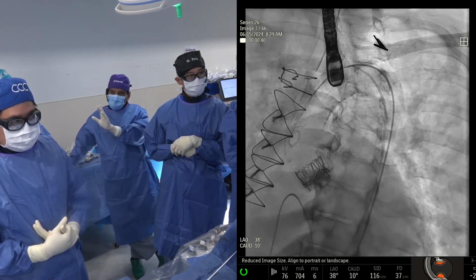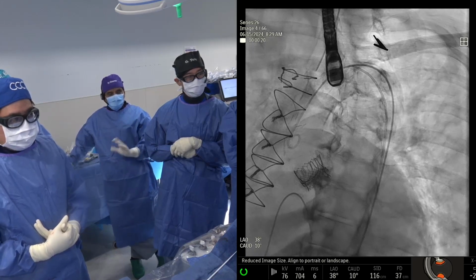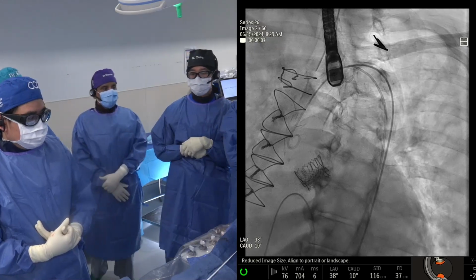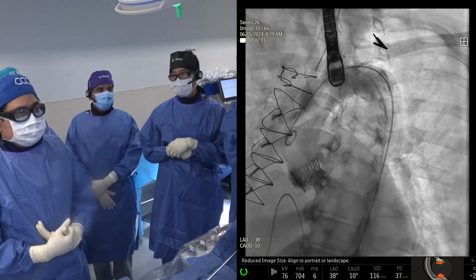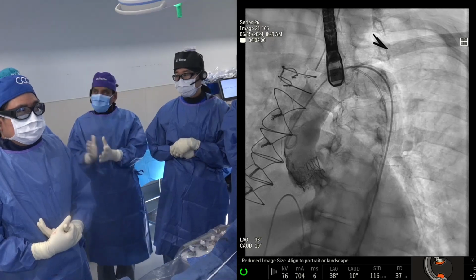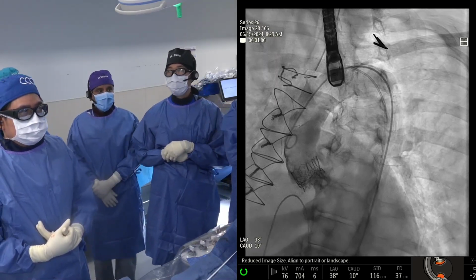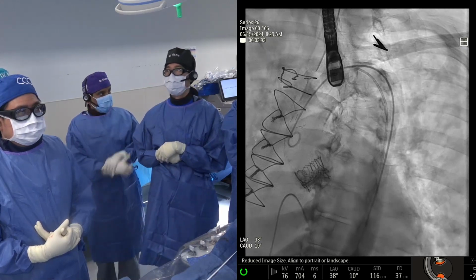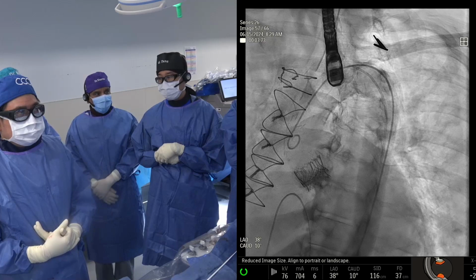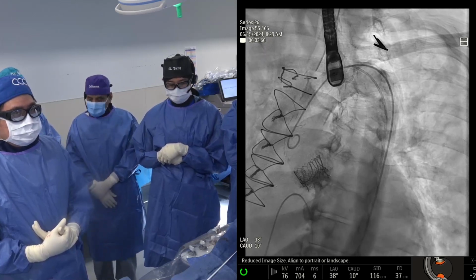In a case like this, with a younger patient, you may decide to. The difference is whether you do it pre or post, and based on the TVT data published in JACC Interventions, maybe pre is better. We actually used to do post, and I know Raj Makkar used to do post also, but they have all shifted to pre when I spoke to him last time, because we did have one trouble. One patient could not be fractured, and then we developed severe AI. That was one patient after a post fracture; we thought we'd do it, but rarely do.